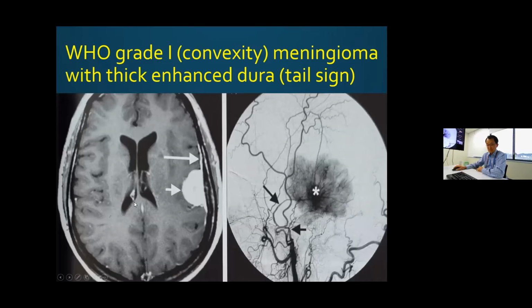So this is again the frontal horn, temporal here, and you can see sulcus here, this gyrus here. This is a gray matter, this white matter. In any adult, you often see just tiny high spots around the white matter, that's a microinfarct or degenerative changes of the small vessel disease.